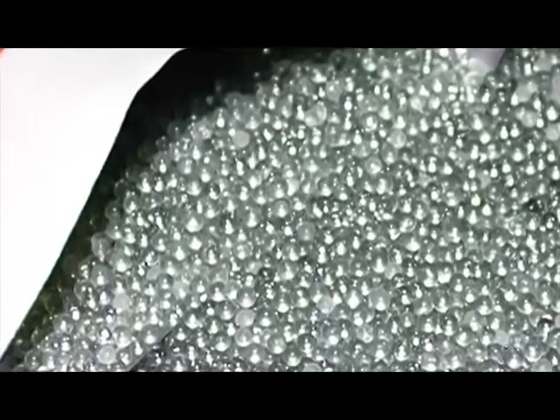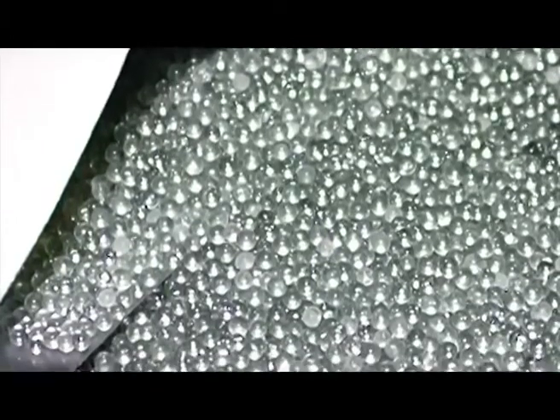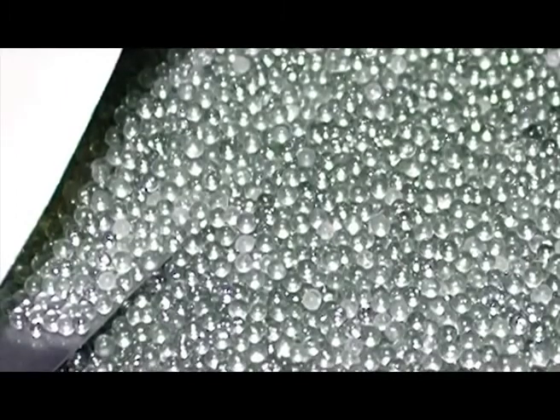Next comes glass bead sterilizers. Glass bead sterilizers have a central well filled with glass beads which are maintained at high temperature, approximately 500 degrees Fahrenheit.